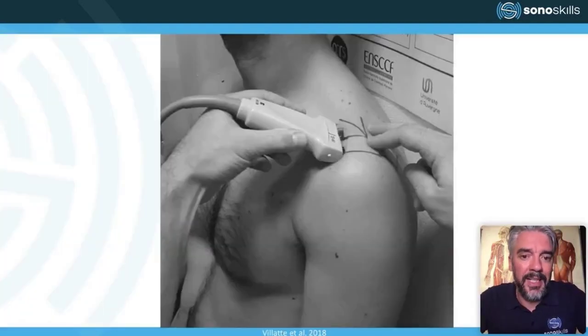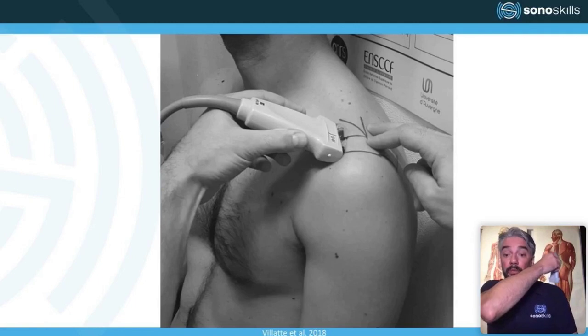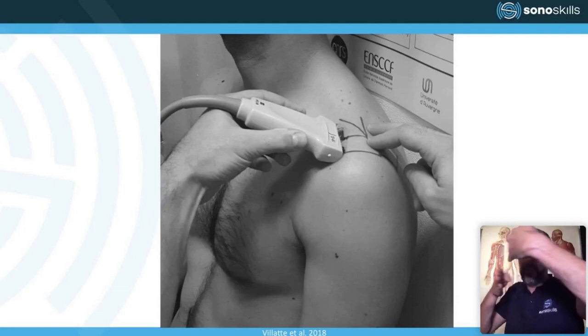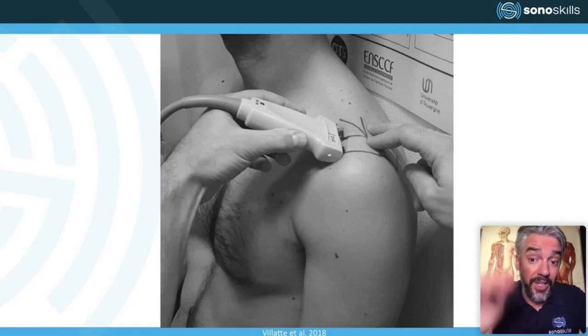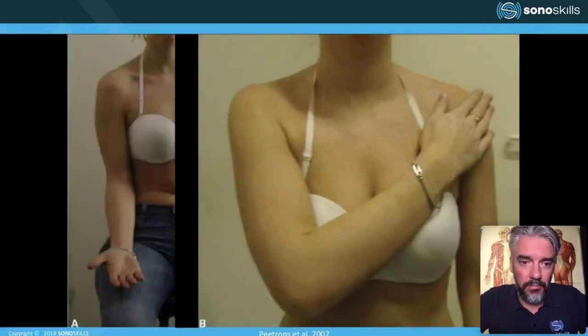That's actually all. Instead of this approach, you can also use a more anterior approach. If we scan really on top of the shoulder, you can see this alignment, but when measuring more from the front, we can see this alignment, and that's sometimes also interesting to see, especially when assessing certain Rockwood classification stages. So try this, I would say.